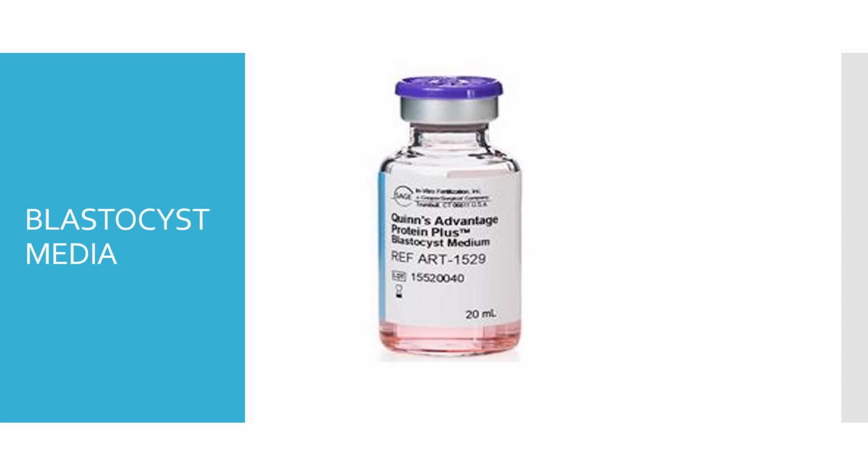Heparin is an anticoagulant used to prevent blood clotting. Phenol red is a dye used as a pH indicator, changing from orange, which is acidic below pH 7, to magenta, alkaline above pH 7.